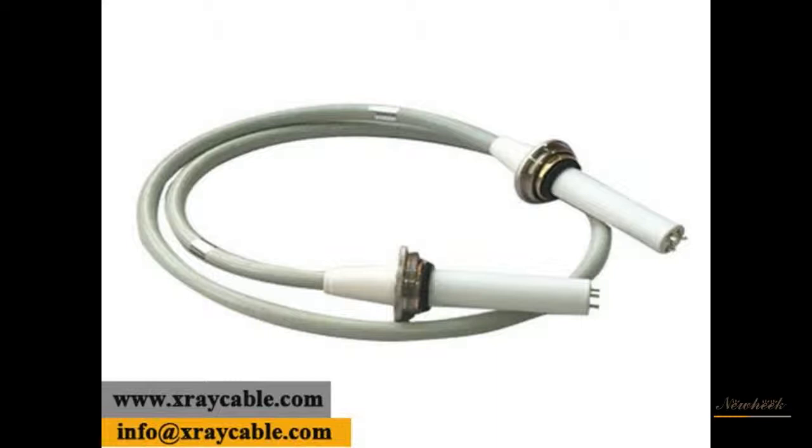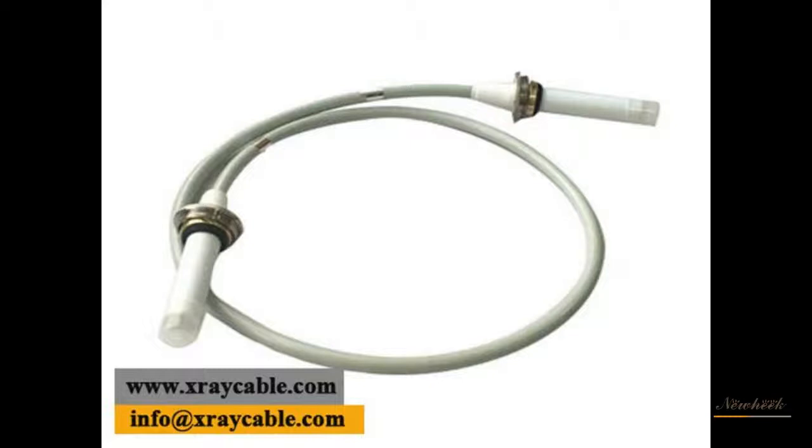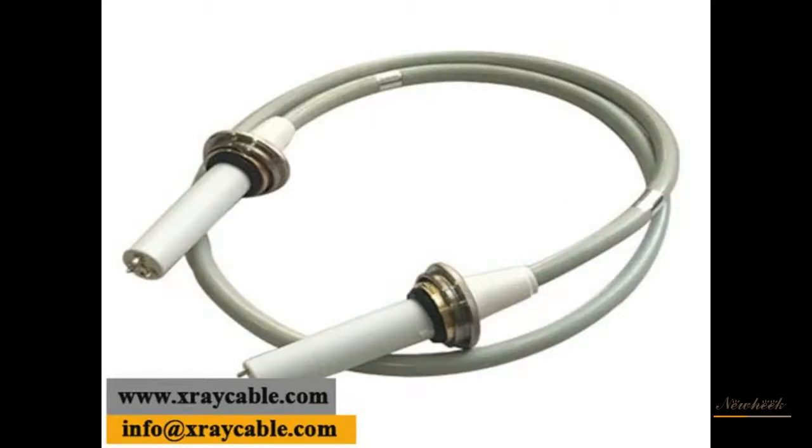The high voltage part of the line is not complex. Complex is the process, and the high voltage components are sealed. It is not convenient to directly open them to test. After opening, the packaging needs special equipment.